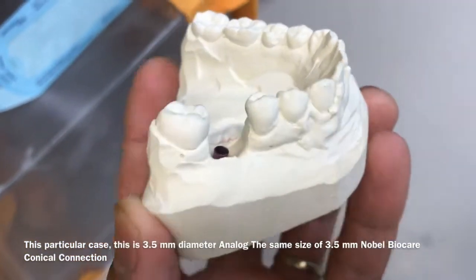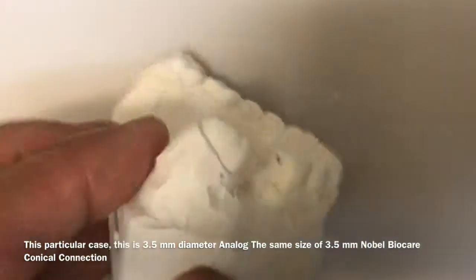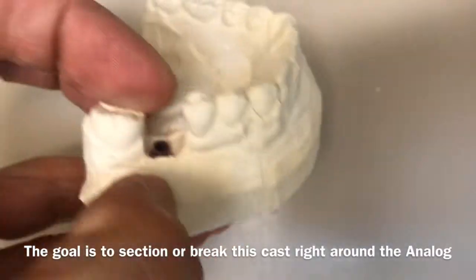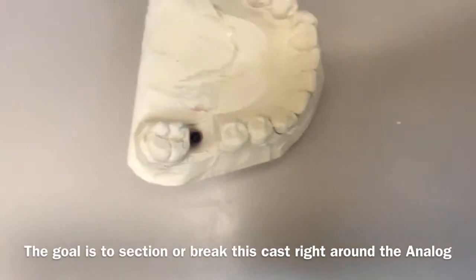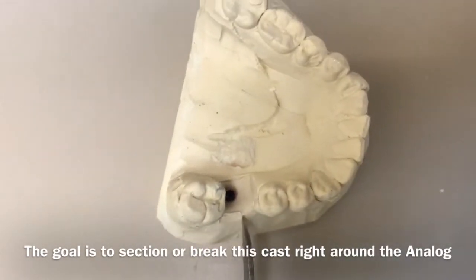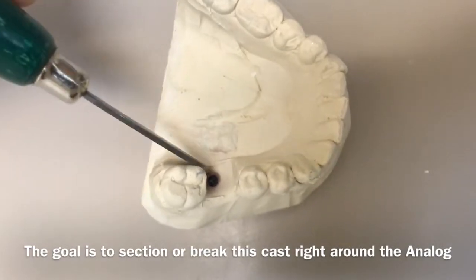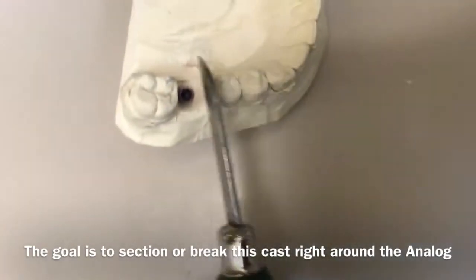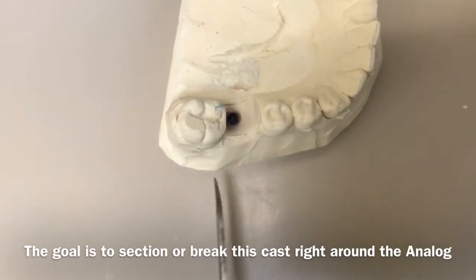So the way you do it — you section it, you break the cast. You would break the cast right here and right here, and then you should be able to take it out. Basically your angle, you cut it, you break it right here.